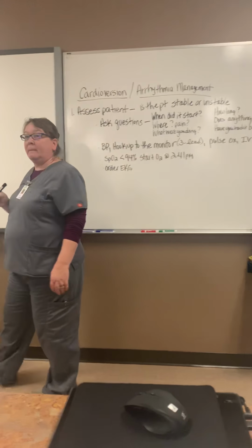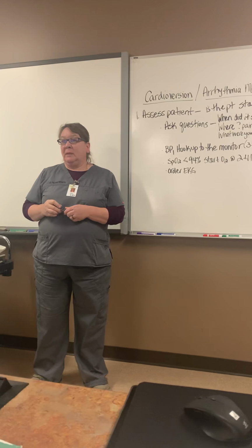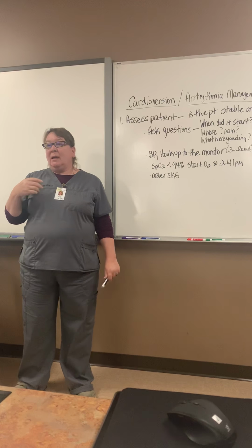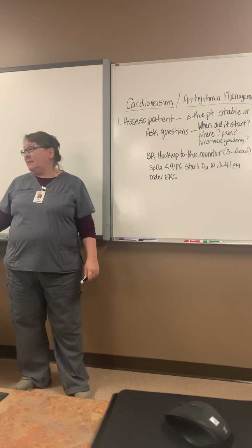Do you hook them up to the CO2? That's the end-tidal, and we'll talk about that when we do conscious sedation. It's for monitoring ventilation. Unless there's a concern about the patient's ventilation, we're not going to routinely do that. We're just going to do a pulse ox like we would typically see in the ER.